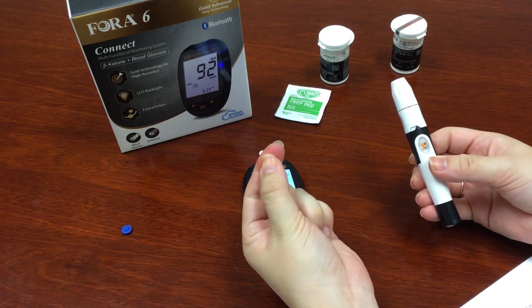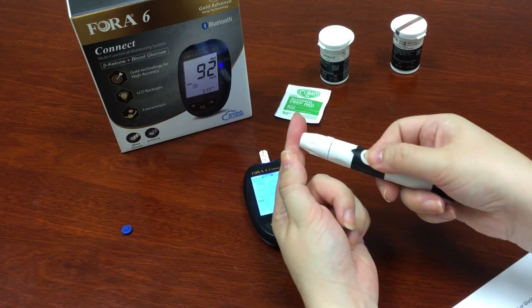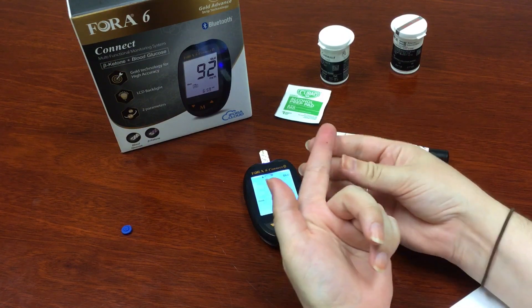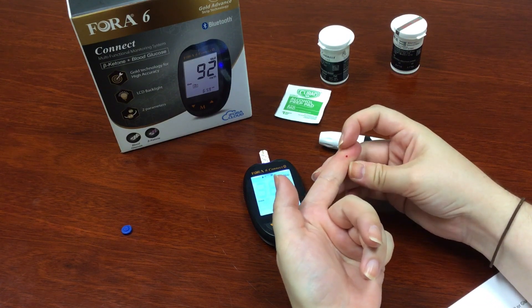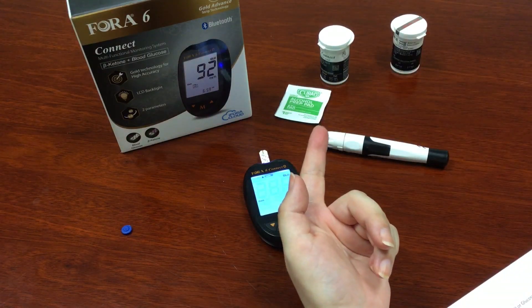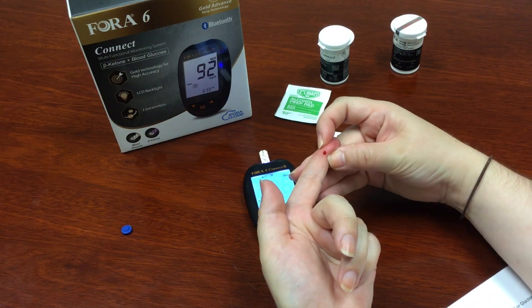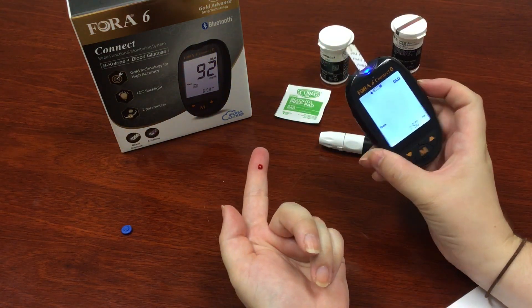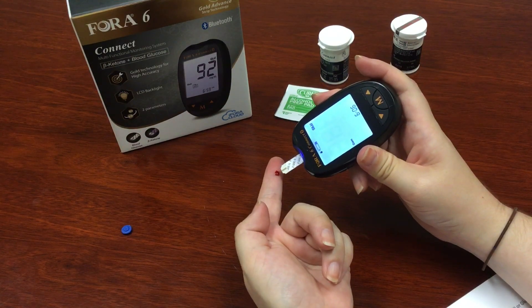Our lancing device is already set. Get rid of the first drop of blood because it's likely contaminated — just wipe that away. Then you'll use your second drop for the test. Take your meter and the strip and put it at an angle in order to get the blood droplet on there.